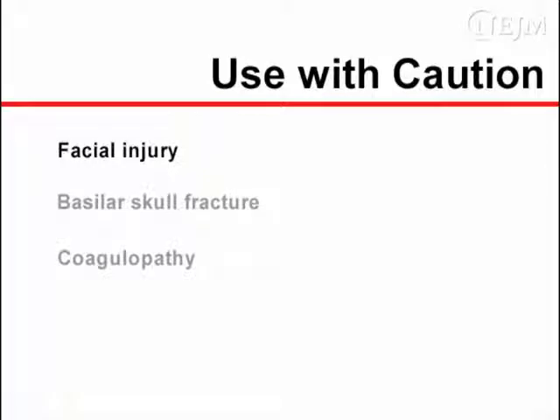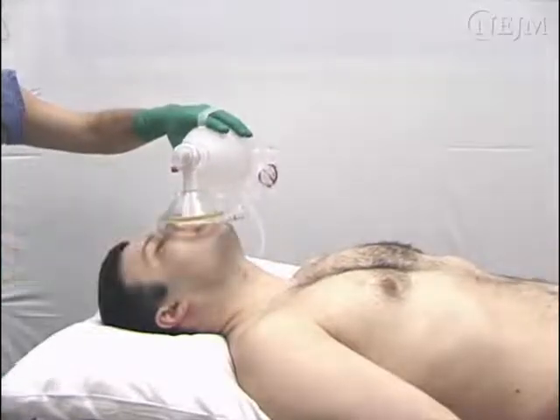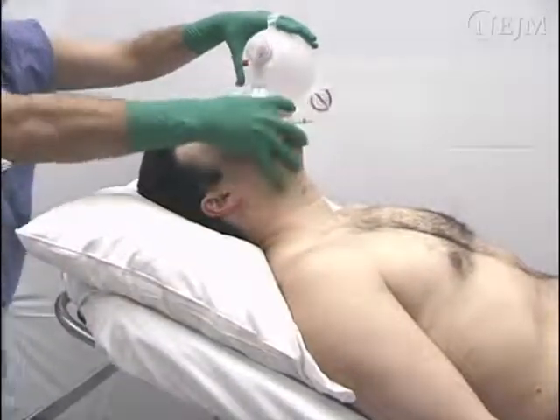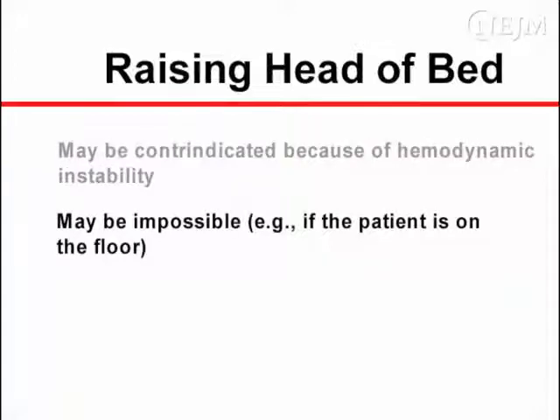They must be used with extreme caution in patients with facial injuries, basilar skull fractures, and coagulopathy, weighing the risk of further injury and bleeding against the need for oxygenation. Raising the head of a bed may facilitate the delivery of adequate tidal volumes, but may be contraindicated because of hemodynamic instability or may be impossible, for example, if the patient is on the floor.